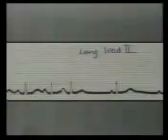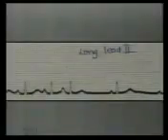With this, we come to the end of this cassette. I expect that after studying this cassette, you will be able to diagnose common conditions with ease. But be aware that there is much more to read in ECGs than what we have seen till now. There are many more fine points and differentiations, but that is for a cardiologist to read. It is beyond the scope of this cassette, which at its best is an introduction to basic electrocardiography.